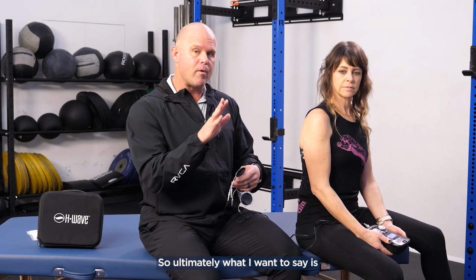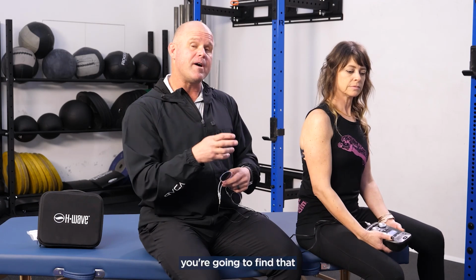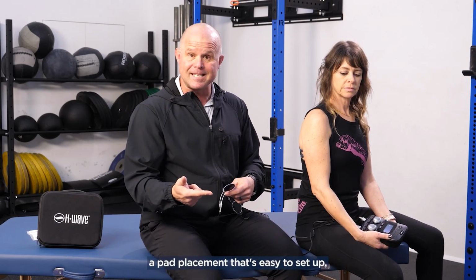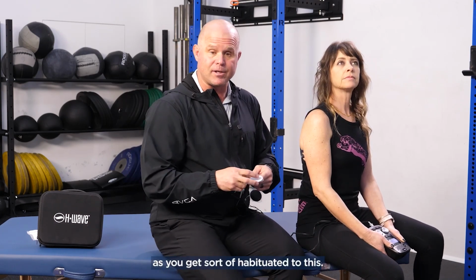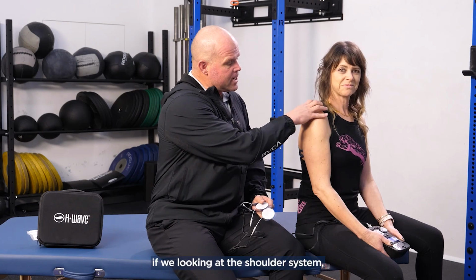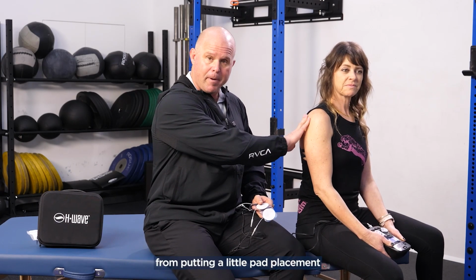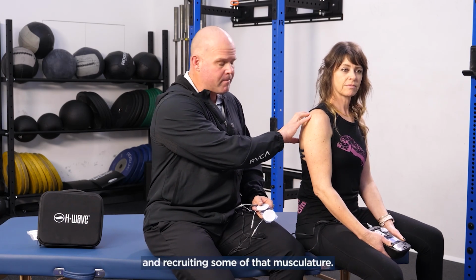So ultimately, what I want to say is pad placement is less important than you think. The first time you do this, you're going to find a pad placement that's very comfortable for you, a pad placement that's easy to set up, and ultimately you can even feel free to move around as you get habituated to this. The idea though is if we're looking at the shoulder system, we may be benefiting from putting a pad in the rear of the shoulder, on the rotator cuff, and recruiting some of that musculature.